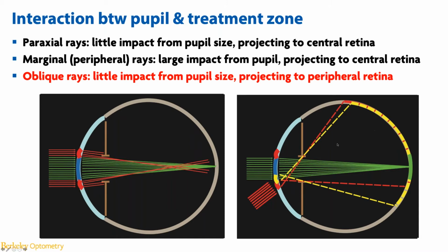But if you are a firm believer that it is the peripheral myopic defocus that's the anti-myopia dosage in Ortho-K, you don't actually need to push too aggressively in pushing this paracentral steepening area to be inside the pupil, because having it shifted inside has pretty limited impact on how far away you can project to the peripheral retina or the extent of this overall projection. So since we haven't fully understood how Ortho-K is working in controlling myopia, simply using one hypothesis to explain a myopia control optimized design at this stage is probably not very sufficient.